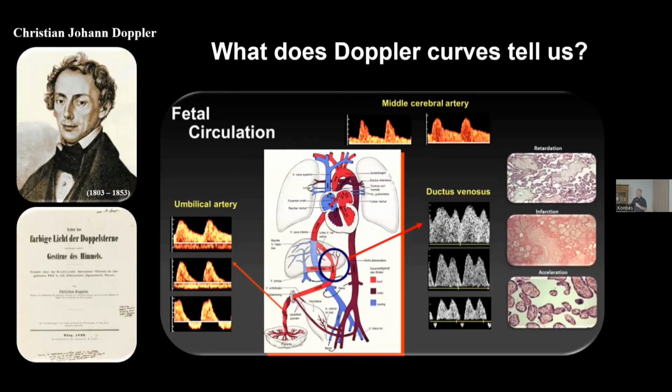And the heart can also adapt for a long time. And then the A wave is increased, the pulsatility is increased. And if it's negative, then we know that within 5 to 7 days this baby could die. And the reason in almost all these cases is some damage to the placenta, especially in cases of preeclampsia or patients with bleeding in early pregnancy.